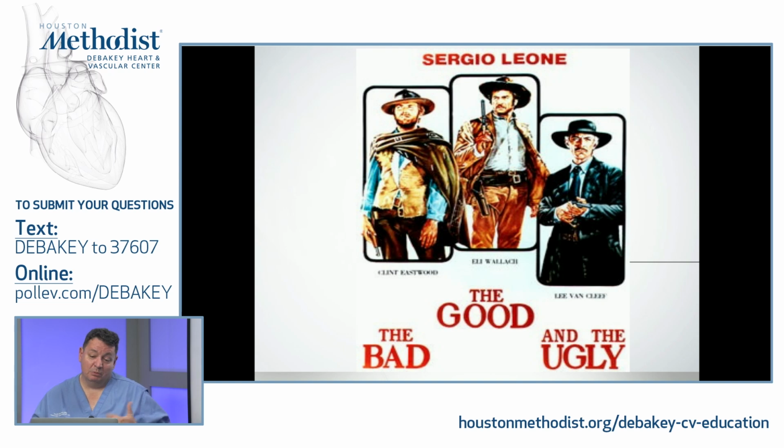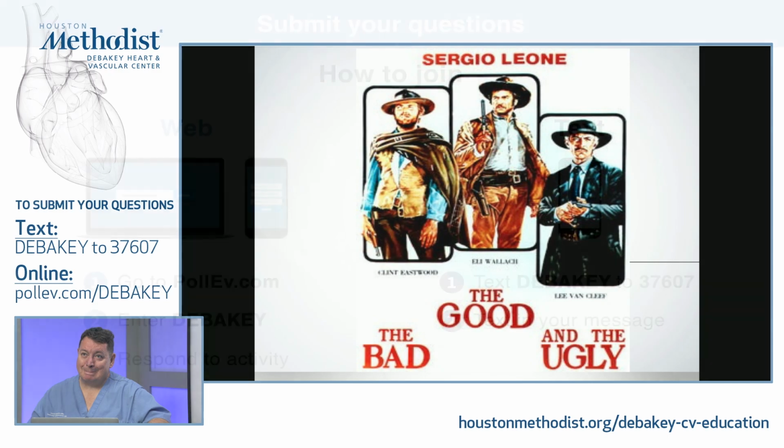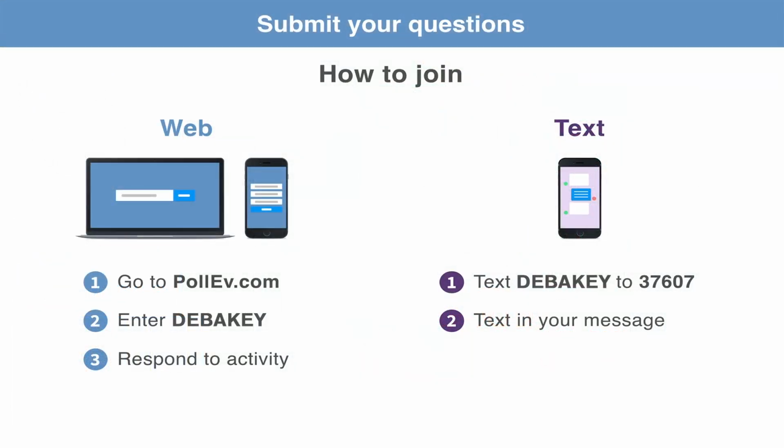So I wanted to talk more about the good and the bad bubbles. So I guess today I'm going to finish up with these PFOs, but because of this request, I really want to show you guys where we see some bubbles. And please ask questions. If someone else is still with me, please send us more questions.